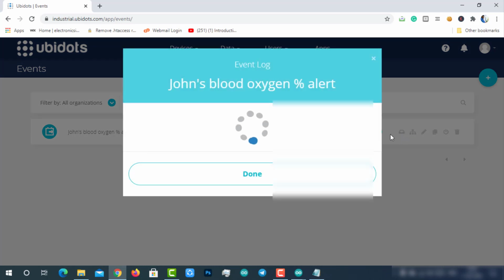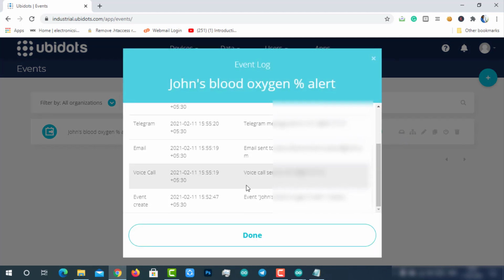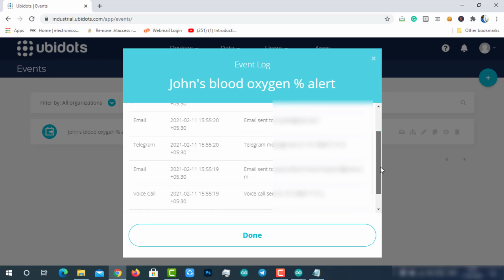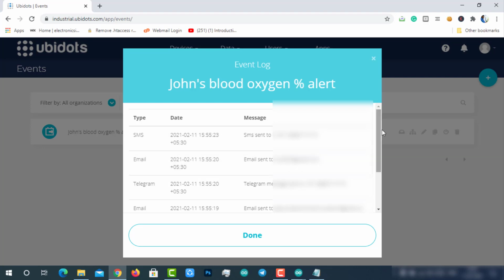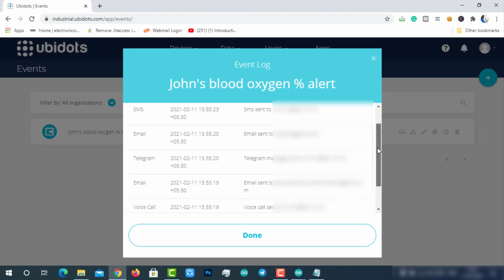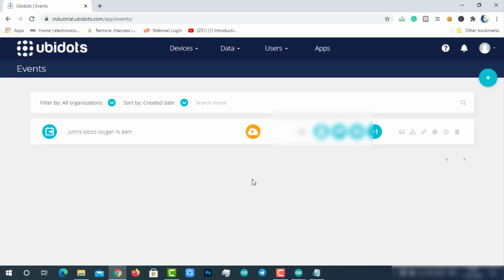at the event log option. If there is any problem with the mobile number or email, the alert cannot be delivered, so you never receive an alert. In that case, you can check here. If there is any problem, a detailed description of the problem can be found here. It will help us in debugging. So all these alerts are triggered when the SpO2 value is less than or equal to 95 percent for one minute.